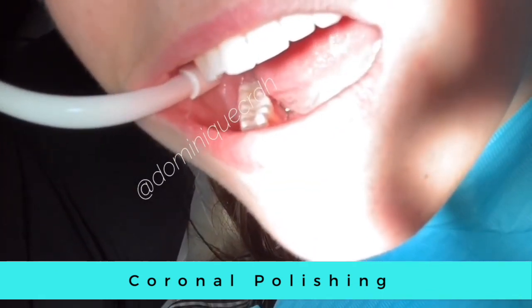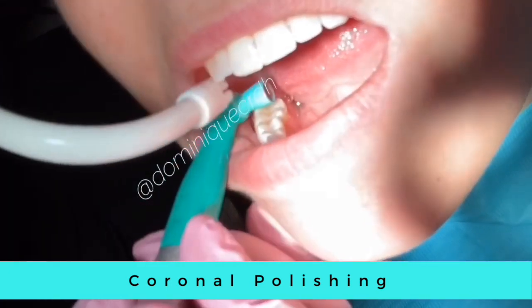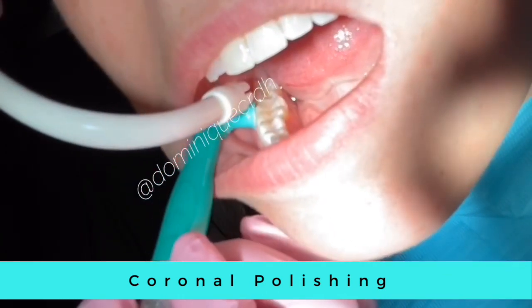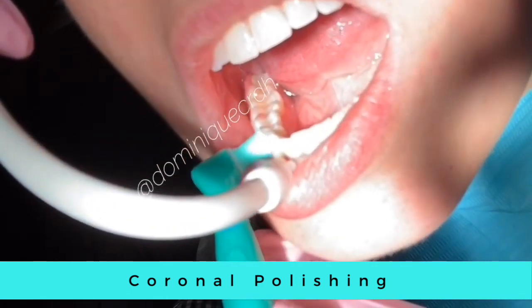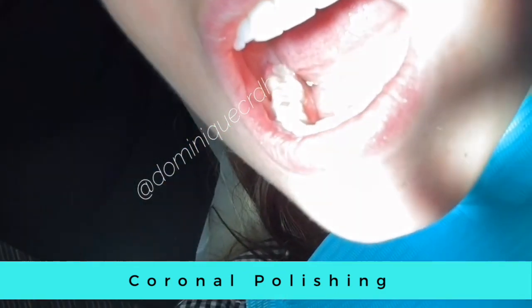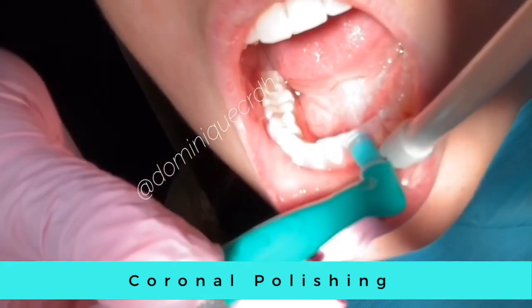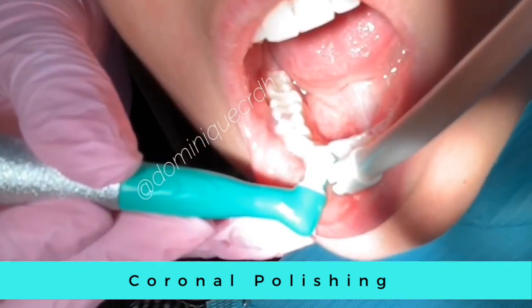You'll just be following the profi cup with the tip of the saliva suction. As you are cleaning, go right near the cup of the profi angle with the tip of the suction and gather saliva as it accumulates inside the patient's mouth. It's a really simple procedure — I like to use it to retract and also to capture saliva as it accumulates around the cup of the profi angle.